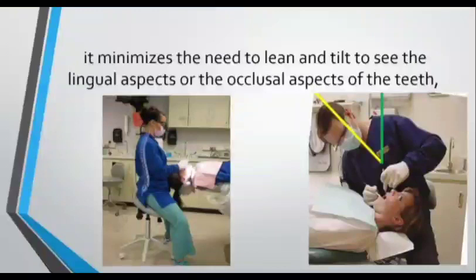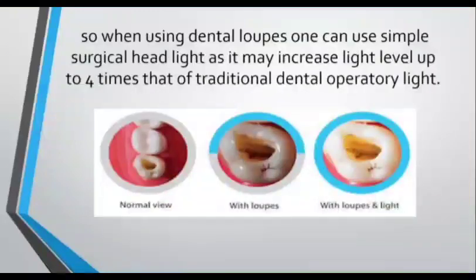in the dental practice. Many dentists fail to continue the use of the loupes because they don't give themselves enough time to become used to it, as it shows more details and needs a little time to practice, or just because they use the dental unit light only. In fact, the more we use magnification, the more we need illumination.